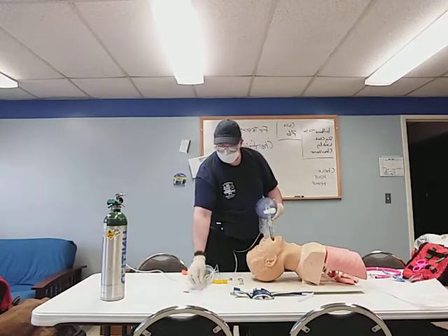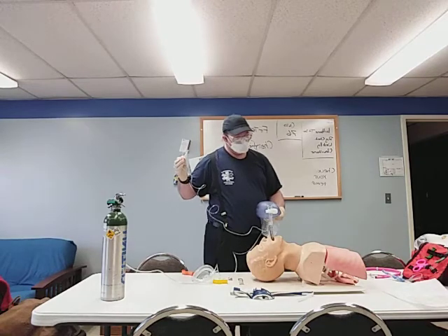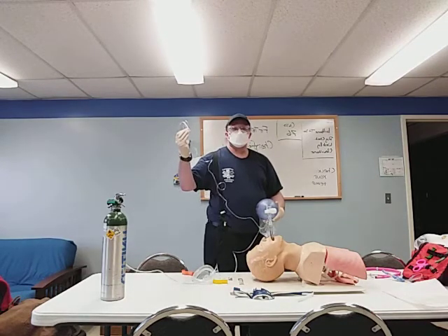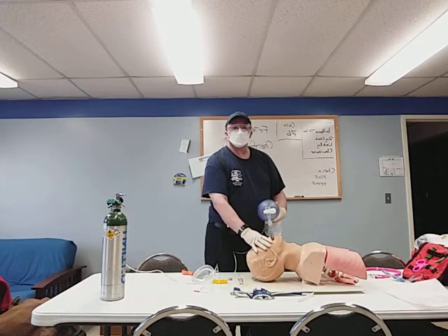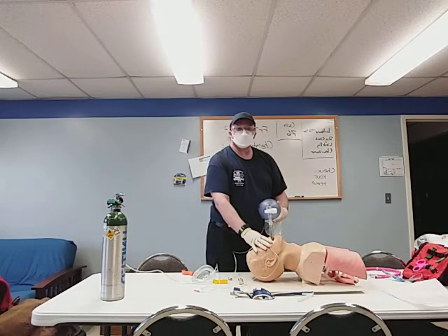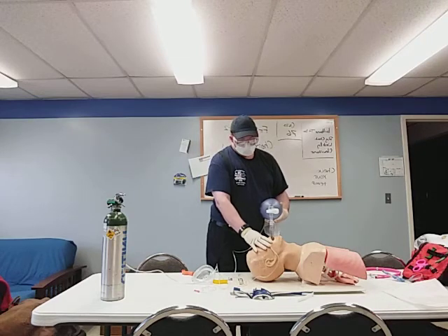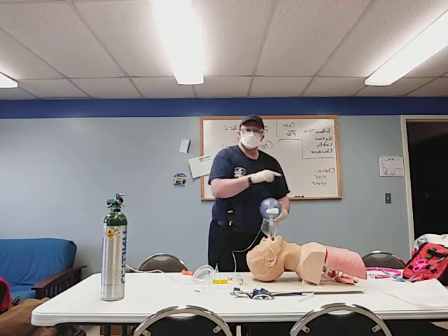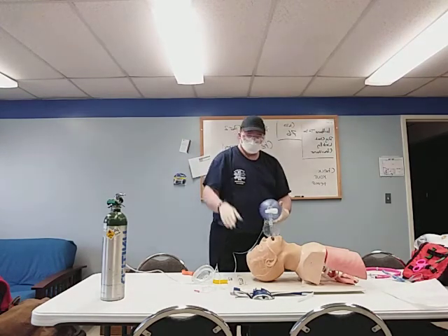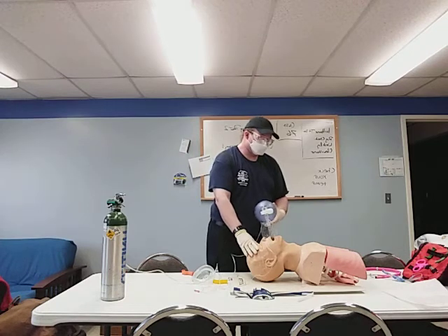I've attached my capnography adapter, and I will attach this to the cardiac monitor, and I'm looking for a nice waveform that is in the 35 to 45 millimeters of mercury range of CO2 at a rate of 10 to 12 per minute, and it should look like this, without the sound effects.